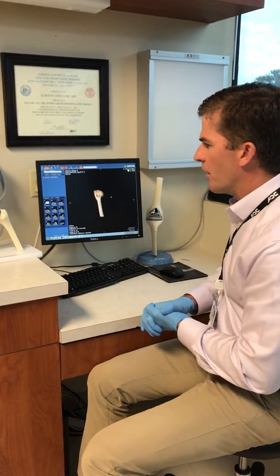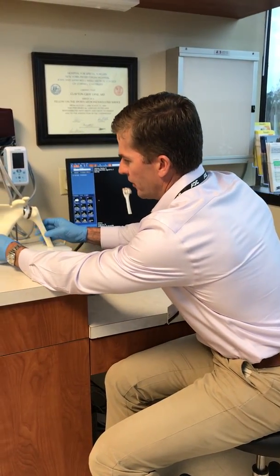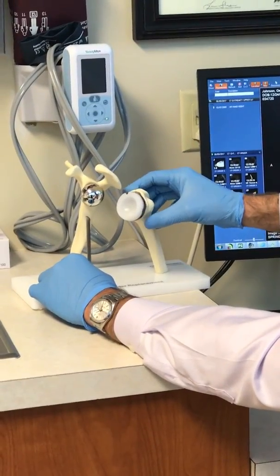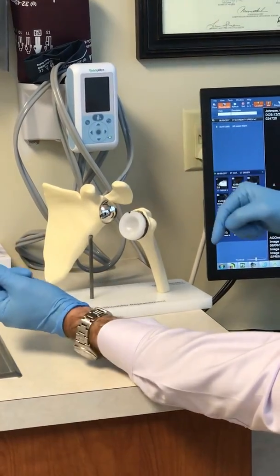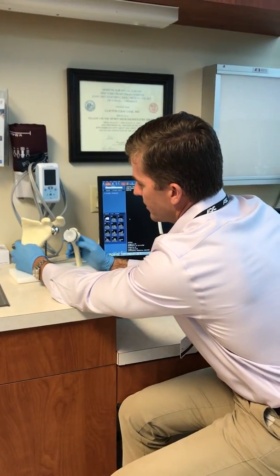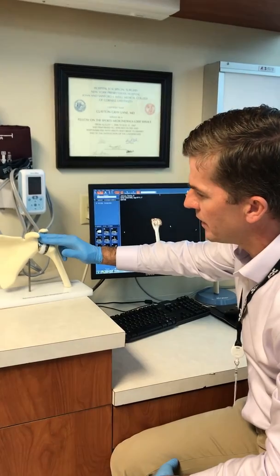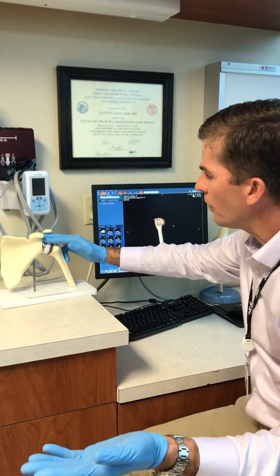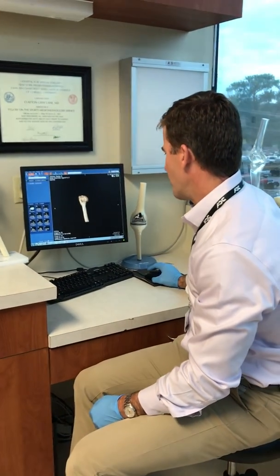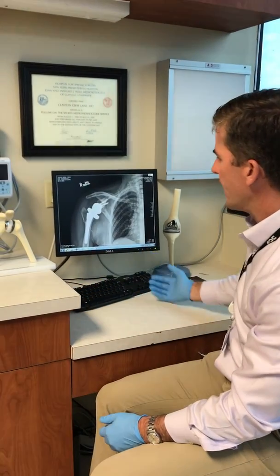With the latest treatment, we can do something called a reverse shoulder replacement, and that's this model here. Rather than doing a regular shoulder replacement where we have the ball on the humerus side and the cup on the scapula, we've switched that — that's why it's called a reverse. What that does is it makes her shoulder function without a rotator cuff, so the rotator cuff that was injured in her fall is no longer needed for her to lift her arm. This is her x-ray from today.